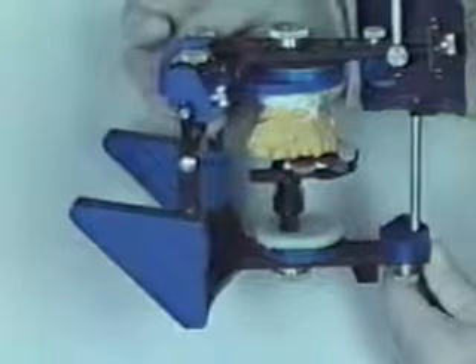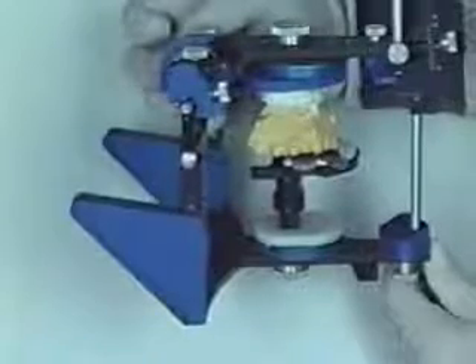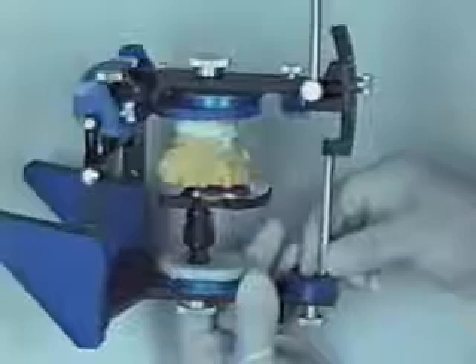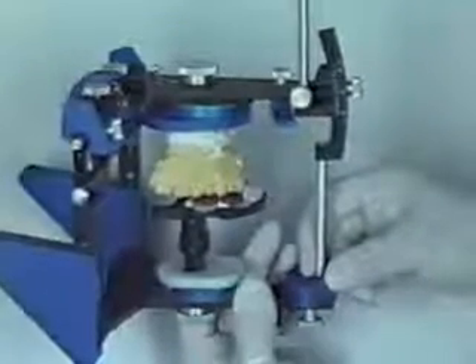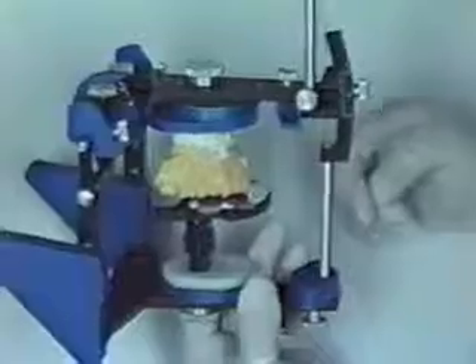The cast is held in position until the stone reaches its initial set. Notice the adjustable mounting platform becomes a built-in support stand for the mounting procedure. Once the mounting stone has set, it's important not to attempt to open the articulator, as the vertical wall in the maxillary tray interferes with the maxillary cast.